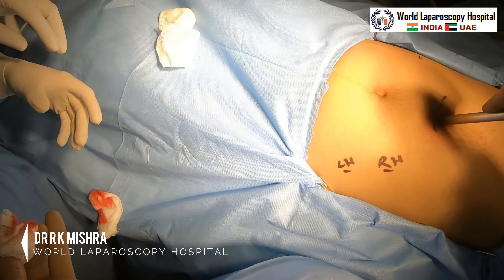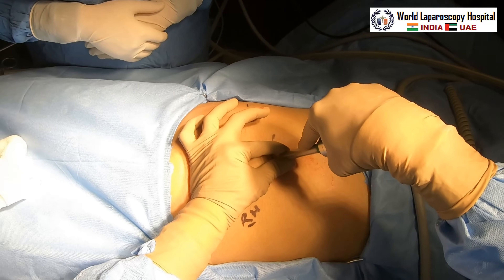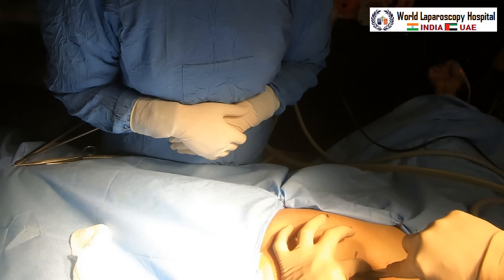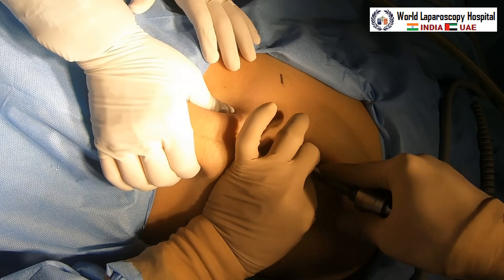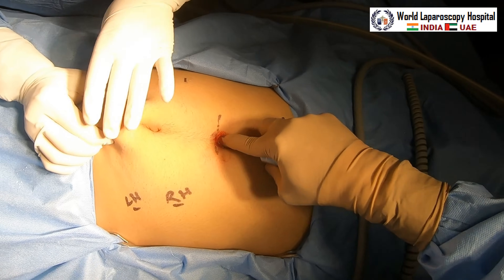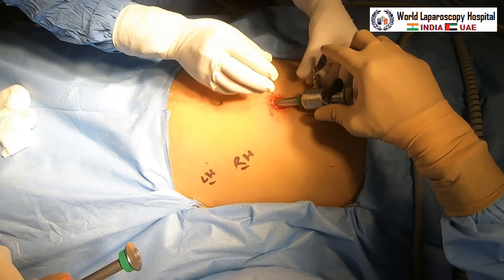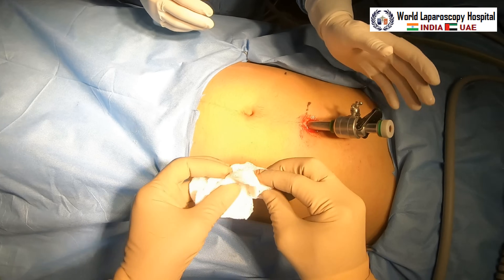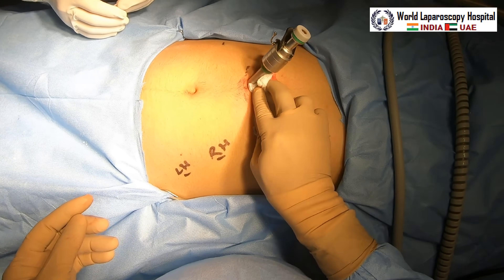By a screwing movement, try to enter into the abdominal cavity. All these activities should be a little fast because there is already bleeding inside. By a screwing movement, enter inside the abdomen. Once the trocar is in, the telescope will be introduced. Clean the cannula tip so that the telescope tip is not stained.